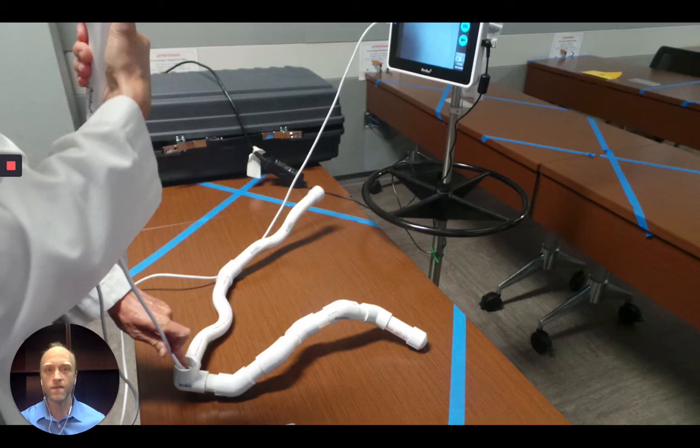I borrowed this idea from Denver Health after I saw it on their Twitter feed. You can use PVC piping to make a maze to practice manipulating the scope. The maze provides much more robust practice than just a standard airway mannequin.